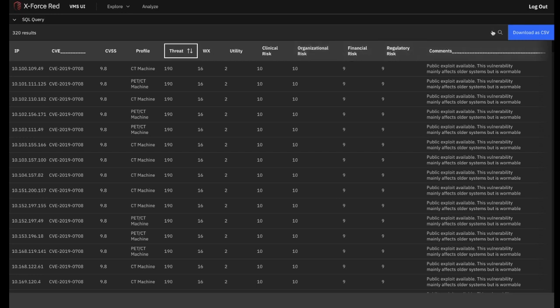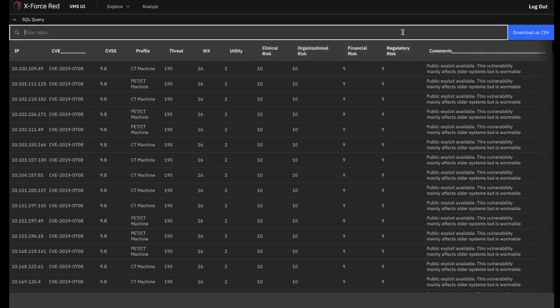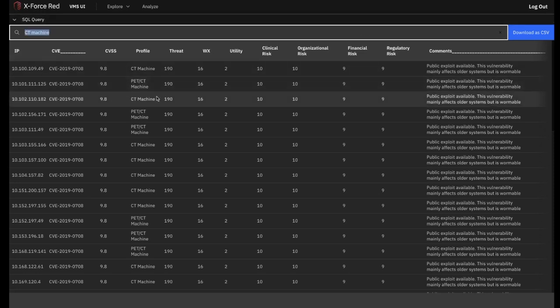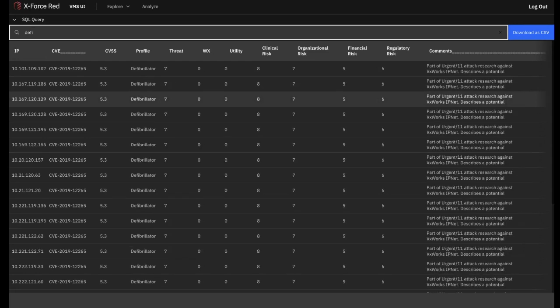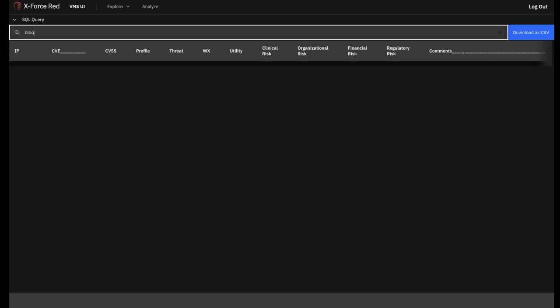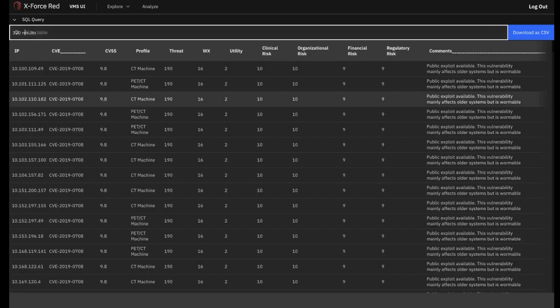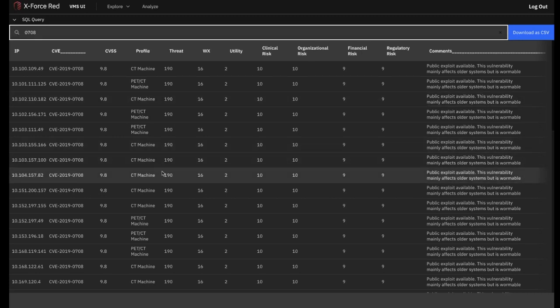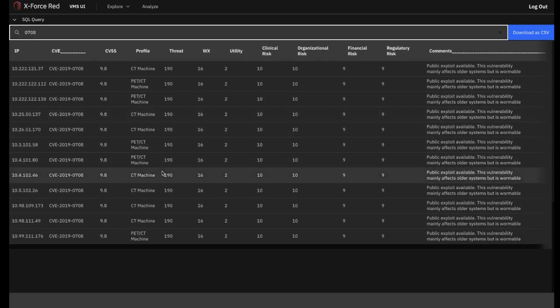Besides this, you can also use the specialized search function to look through the data, for example, searching for specific assets and all the vulnerabilities associated with these. As you can see here, we searched for CT machine and we looked for blood gas analyzers and defibrillators. We can see what would appear and what wouldn't based on what's been detected within the hospital's network. We can also type in specific CVE IDs to identify every instance of these within a specific hospital's network.